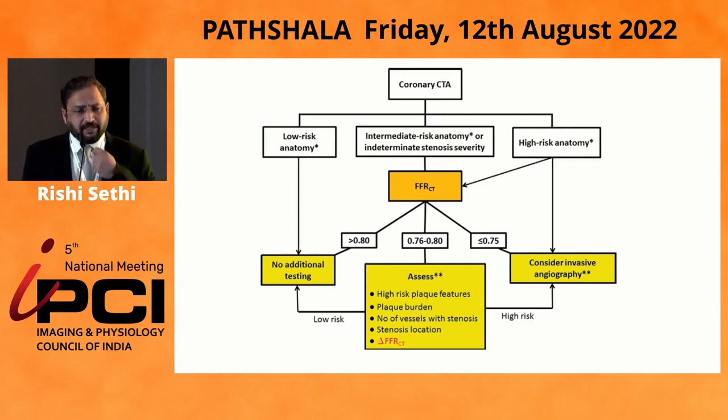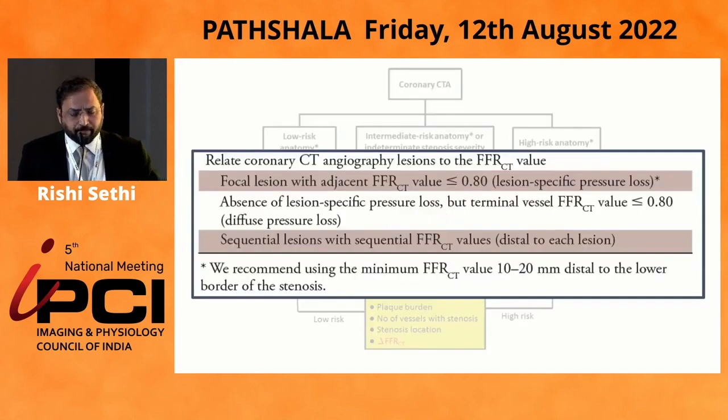Another advantage of a CT angiogram based FFR is that, of course, it's non-invasive, but it also gives values for every single vessel, while for invasive FFR, you can only interrogate one vessel at a time.